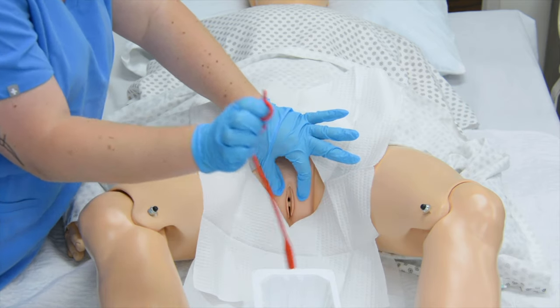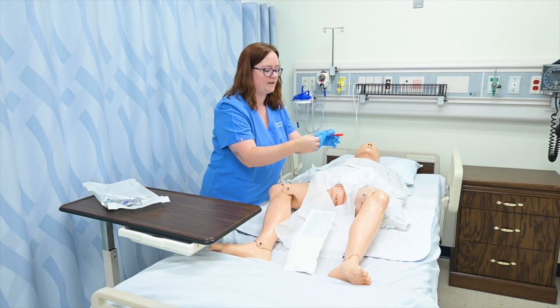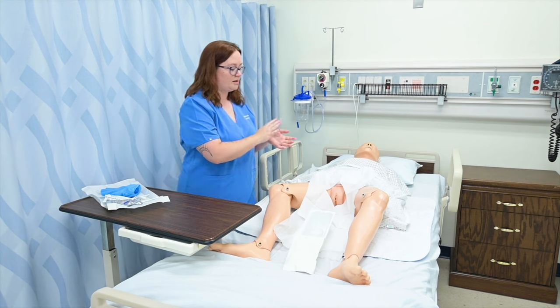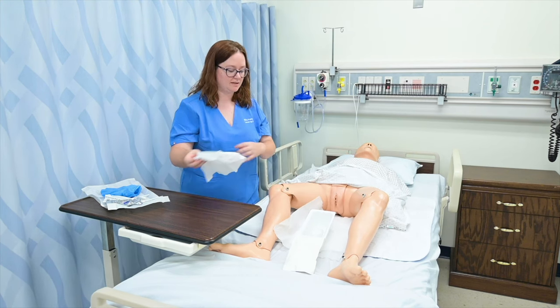I like to kind of twist it up in my hand like that, and then I can even go ahead and wrap it up so that it doesn't spill anywhere, and then I would discard of all of that. And then I could put new gloves on and simply clean up my patient.